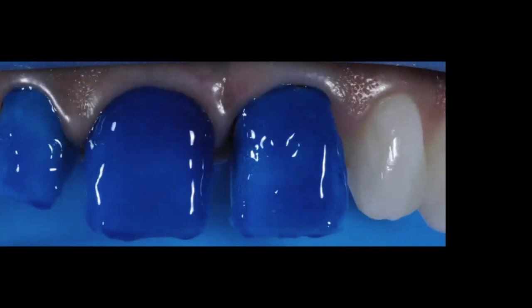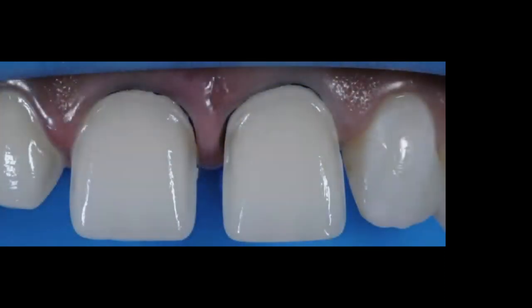Use a very thick etchant — this is important. You don't want a runny etchant that spreads to neighboring teeth; concentrate the etching only on the teeth you're restoring. I bond all three veneers at the same time. When selecting your adhesive, make sure it has a very low film thickness, and apply two to three coats using one microbrush on every tooth you're going to bond.